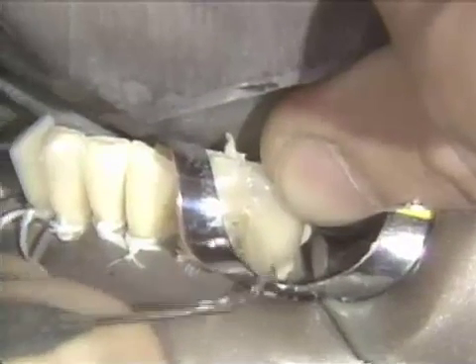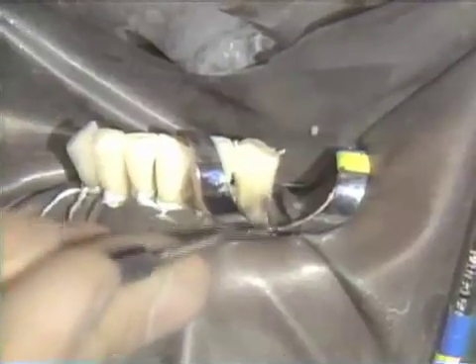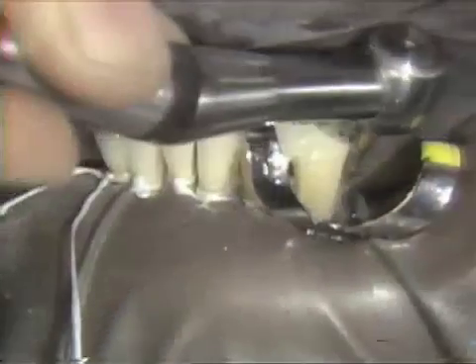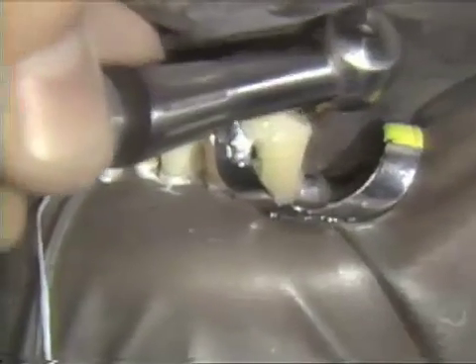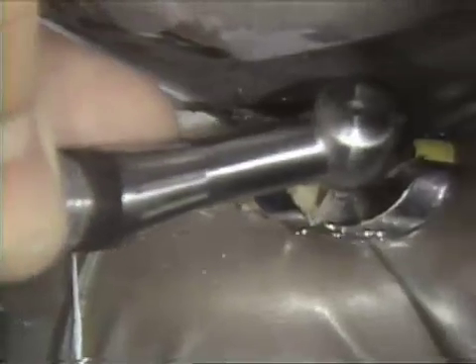The second layer is cured for 60 seconds. Note that these materials cannot be over-cured; under-curing, on the other hand, will result in less than ideal physical properties and may result in restoration failure. A spoon excavator is used to remove the matrix. The surface of the composite is hard with no air-inhibited layer present. A 7901 burr is used to remove the minimal cervical flash. The restoration is complete except for minor finishing.